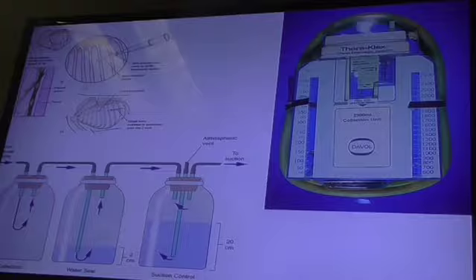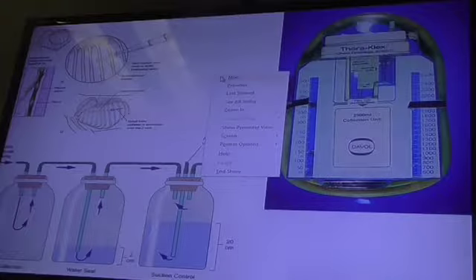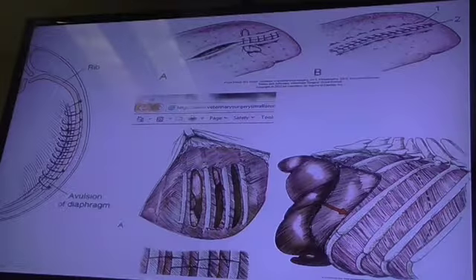This is more chest tube stuff, and a continuous suction device. They make these kits that you can put a hook on continuous suction. Usually, what we do here is just intermittent suction. These are if they have ongoing losses.